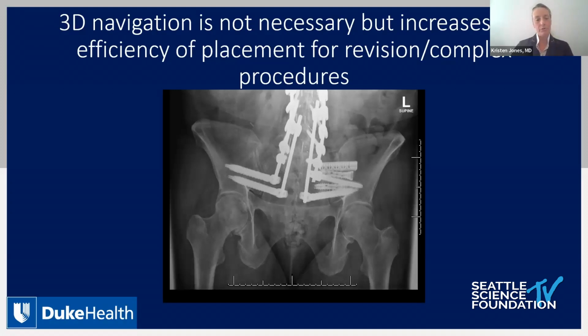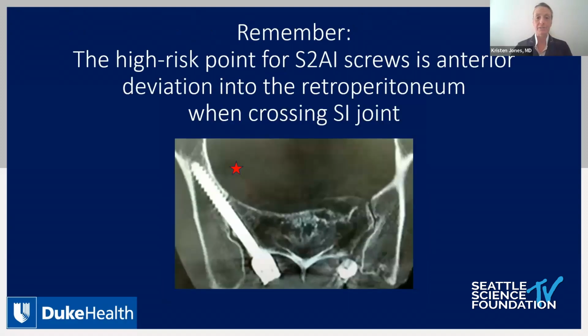So I, of course, recognize that you don't have to use CT-based navigation to do this, but there are a lot of times when it can make your life significantly easier. And I just would say, whenever you're placing these, navigation has inaccuracies. And one of the reasons it does is because the farther you get from the frame, of course, the less accurate the navigation will be for frame-based navigation.